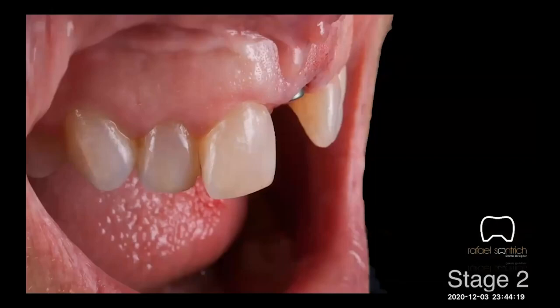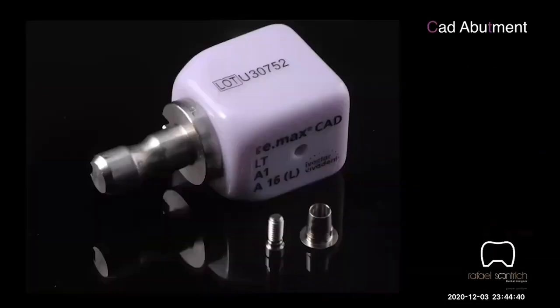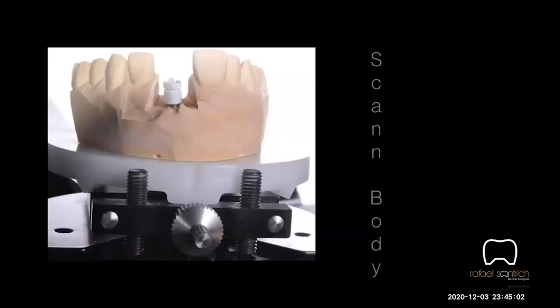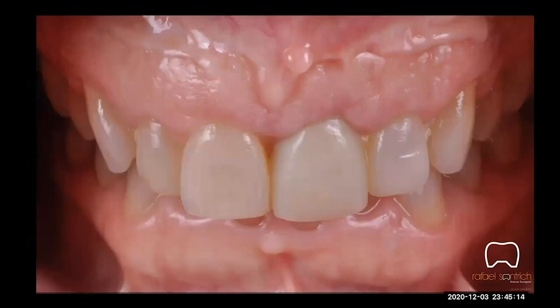So this is the day that I met her in the second stage. This is not the right time to pick the color because the mouth is already exposed, opening the soft tissue, so it's not the right moment to take the color. So in that case, we use an Emax CAD abutment, and it's a nice technique because everything fits 100% between the Ti-base and the block. So we use the scan body to tell the software what kind of implant we are using. We mill the abutment, then we go back to the patient. This is the day that we need to take the color because everything is fresh and stable.